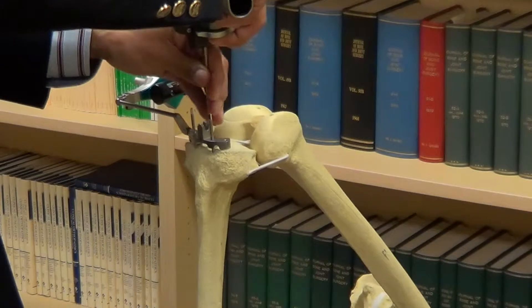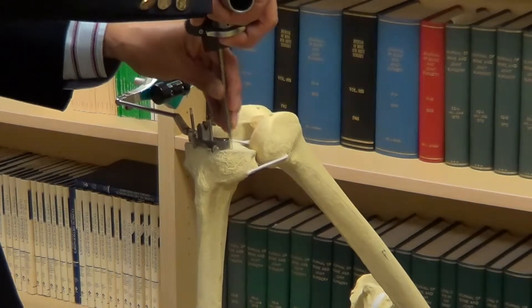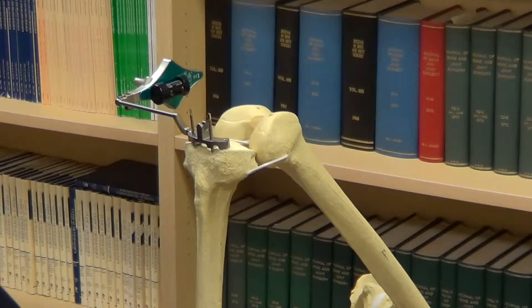We'll map the top of the lower leg bone. We'll map 100 points of reference on the outer tibial plateau. We'll mark the inner side of the ankle and the outer side of the ankle.